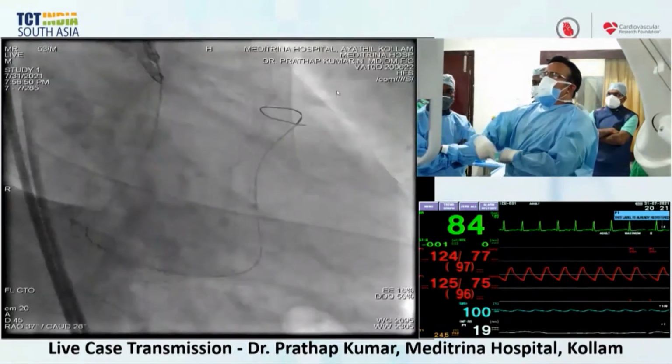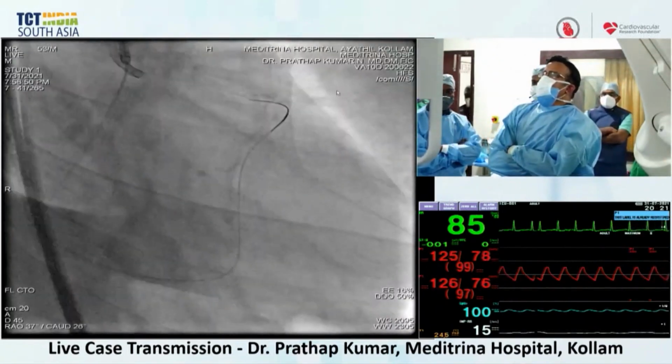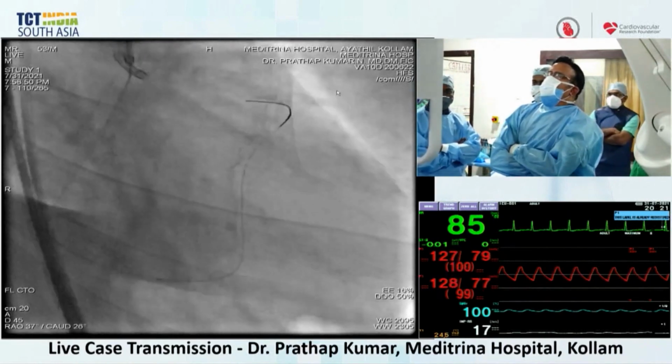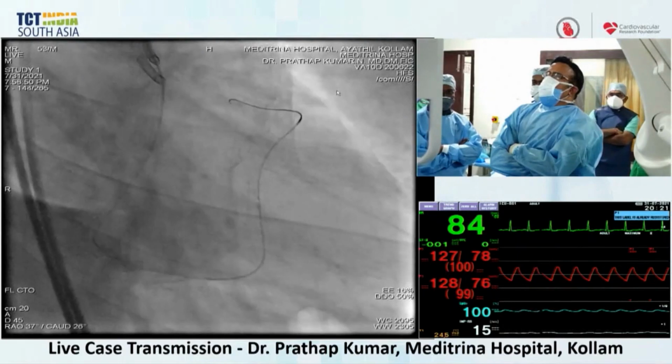Can you show the next one? That's an important point to make, that this is not a microcatheter that's meant to be spun, and the tip will break if you spin it. Yeah. So next, this actually went.